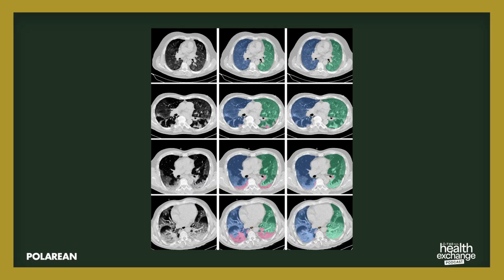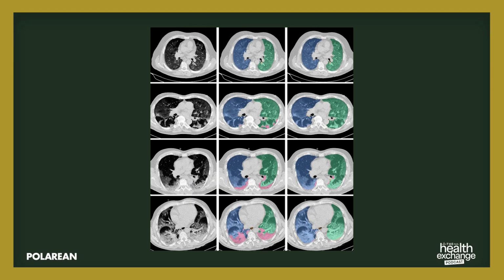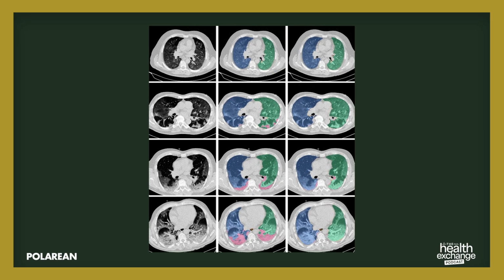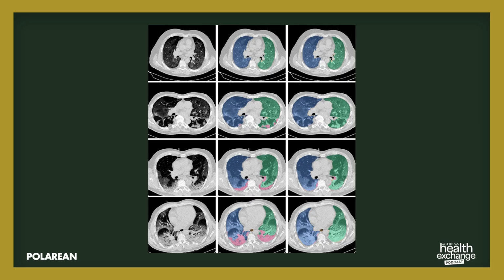And when you're looking at a CAT scan, essentially what you're looking at is a bunch of secondary pulmonary lobules all stacked on top of one another. And when he's talking about slices, he's talking about slices of the lung from top to bottom or bottom to top, however you want to look at it. And then they lay it on a screen and you can scroll through and see the different slices and you're seeing secondary pulmonary lobules all throughout it.